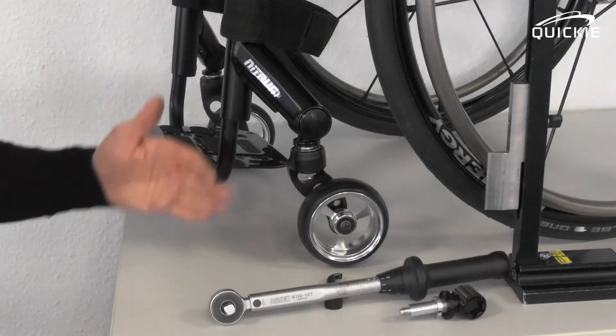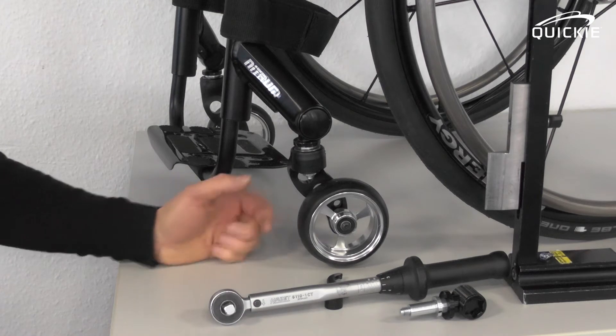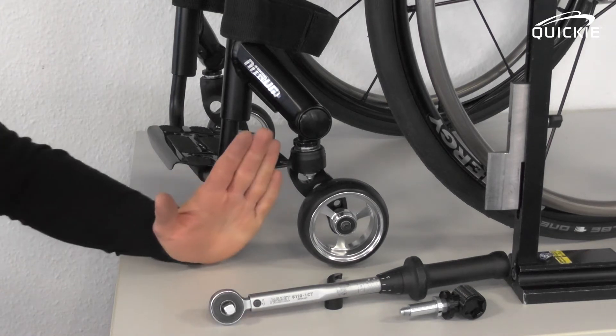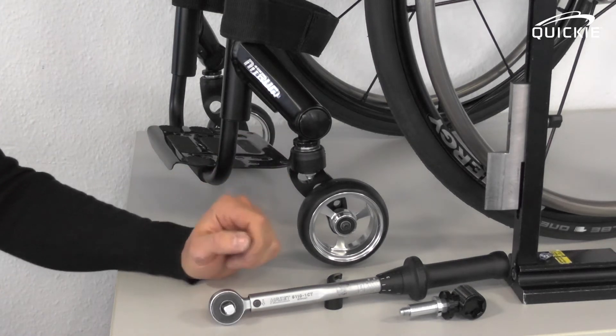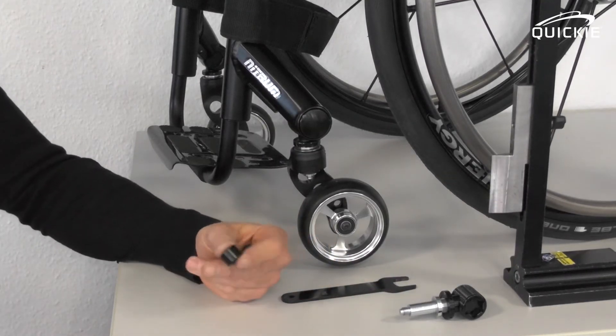You will always have to follow both procedures in a row — first adjusting the caster height, and then adjusting the lateral caster angle. Let me show you how it works.